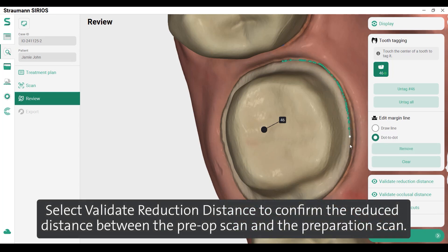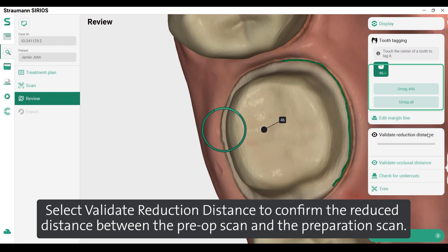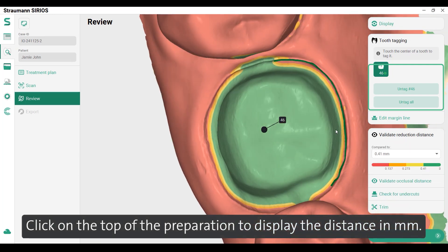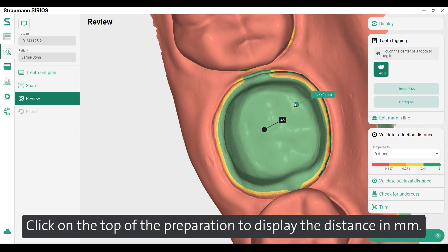Select validate reduction distance to confirm the reduced distance between the pre-op scan and the preparation scan. Click on the top of the preparation to display the distance in millimetres.